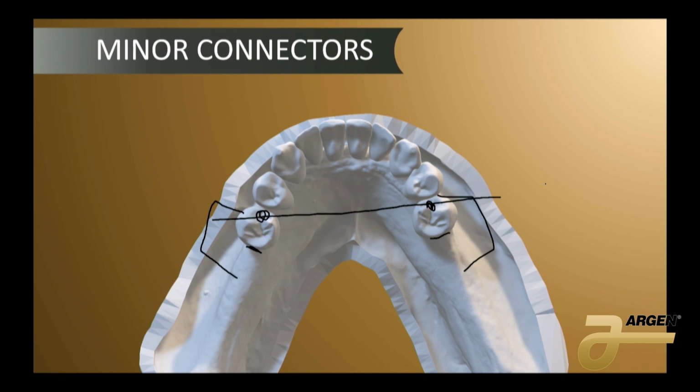We have braced against our one tooth with our reciprocating clasp. Now we have to apply that same knowledge to the whole arch of teeth. So we have to add a reciprocal element to stop it from rotating back and forth. To find where that needs to be, your reciprocating element needs to be perpendicular, 90 degrees, to your fulcrum line. To stop it from tipping, you need something to hold it up. Now you almost always want to avoid a singular rest on the centrals and the laterals. The roots are not deep enough. These are not stabilized enough.